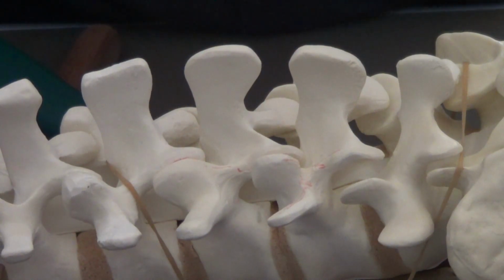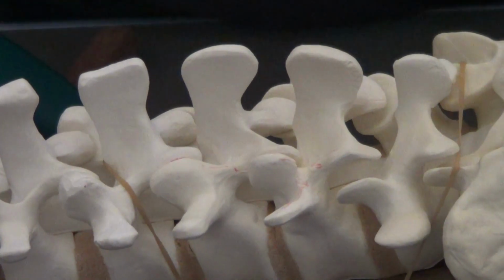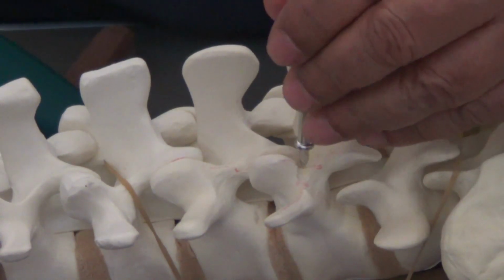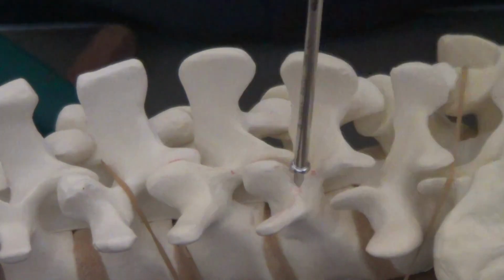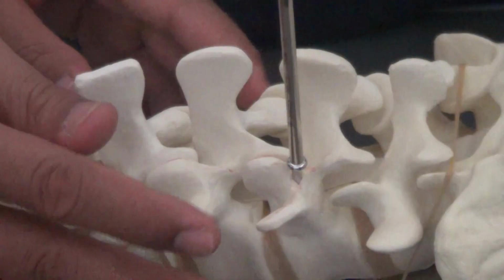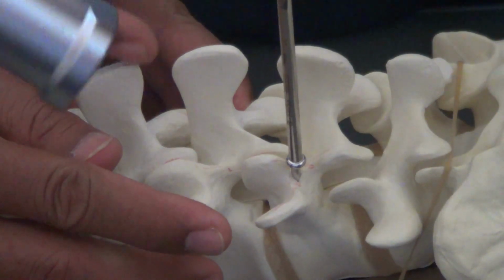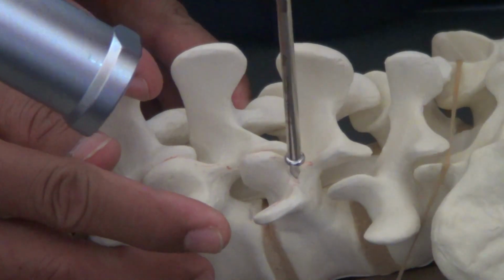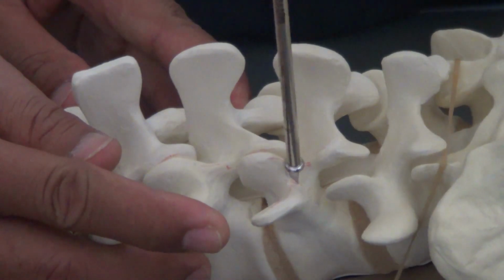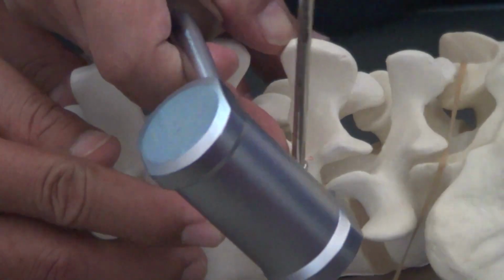And then you take a probe, or a starter. If you nibble it off, then you don't need a starter. Then you enter there, straight in there, and you can use a hammer. Angulate it. You need to angulate in this direction and this direction, right? So 15 degrees, and you go straight. L3, go straight. That will make you an entry there.